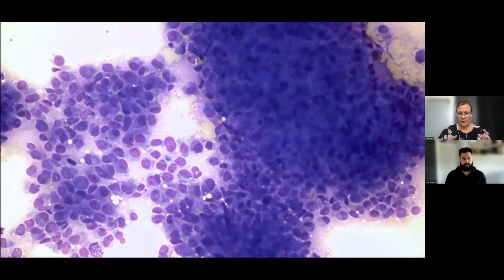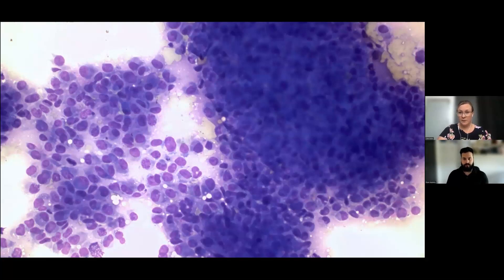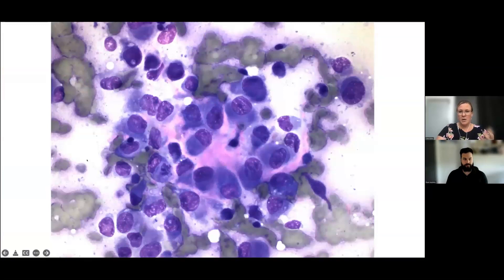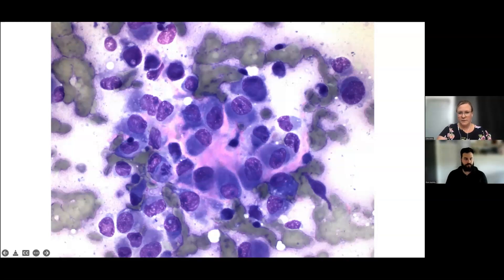At the lower objective we want to see how cells interact with each other, which helps differentiate whether a neoplastic population is epithelial, mesenchymal, or round cell in origin. Already I can see these cells don't look normal — this is very likely a neoplastic population. We can see nucleated cells surrounded by a pink material, which will be important shortly. First, let's look at whether these cells are epithelial, mesenchymal, or round cell in origin.